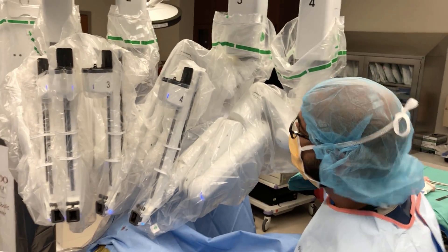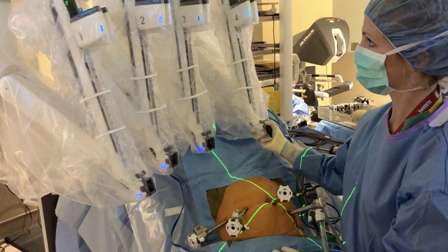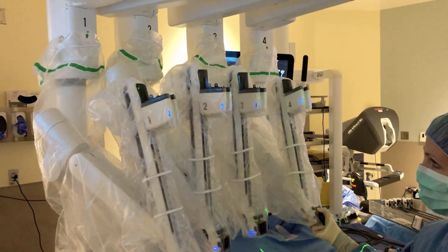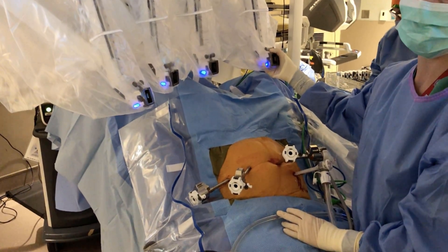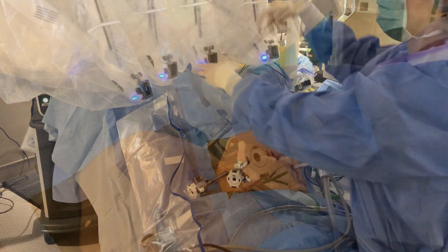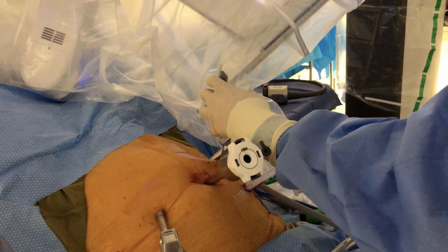The next step is to either raise or drop the boom to line up the height just right. You can do this by pressing the port clutch button for three seconds at either the highest or lowest point that the vertical arm wants to go, which allows the vertical height of the boom to go up or down.